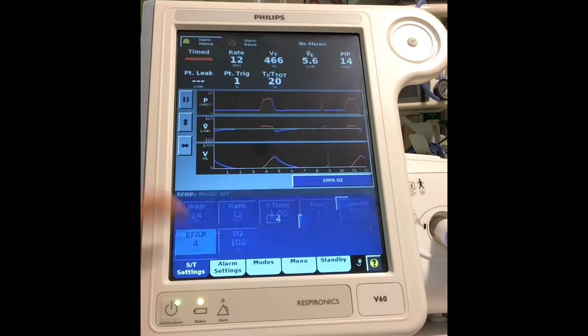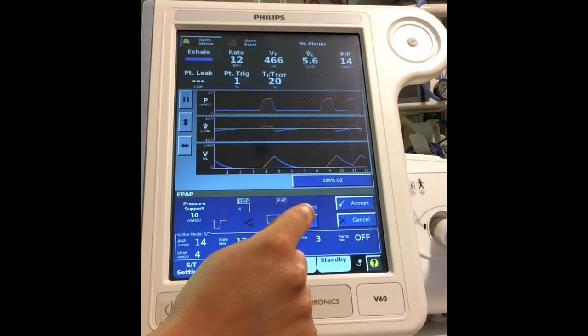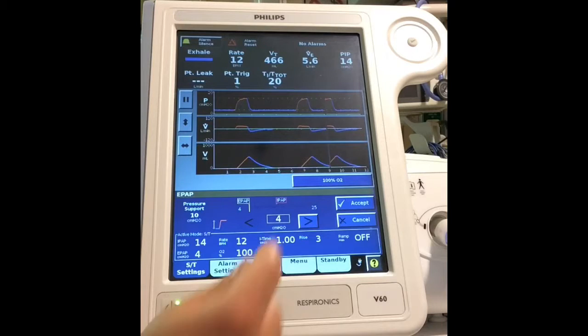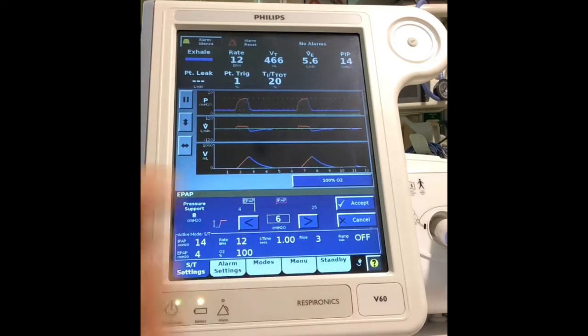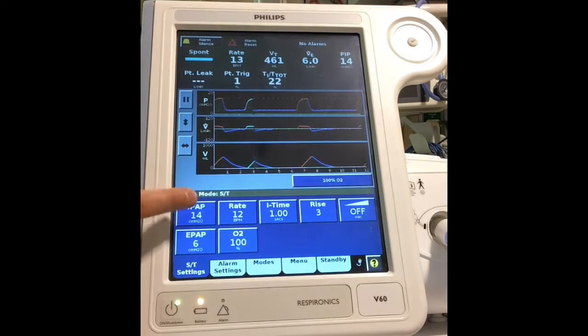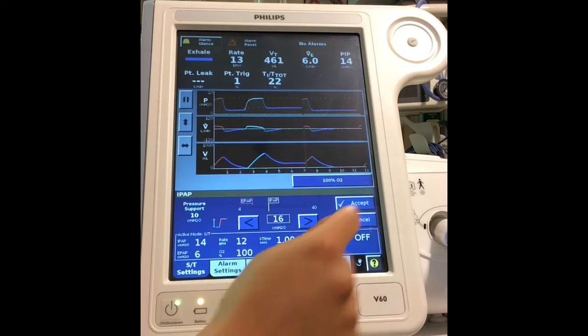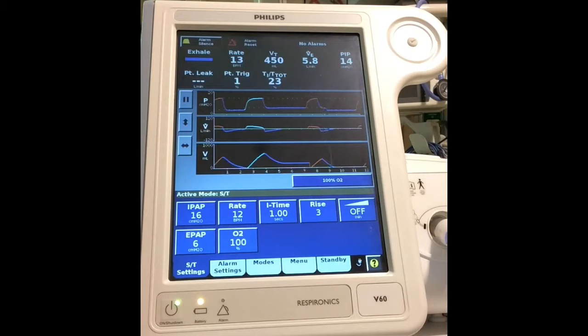So if I turn up our EPAP, you're going to notice the difference between the two is going to go down. So we do have a pressure support of 10 right now, and that's the difference between your IPAP and your EPAP. That's giving us our tidal volume. So if I turn up our EPAP, our pressure support drops, which means I need to increase our IPAP by 2 as well. So now we have a pressure support at 10 again. So remember that. If you turn up your EPAP, you have to turn up your IPAP as well to maintain that tidal volume.